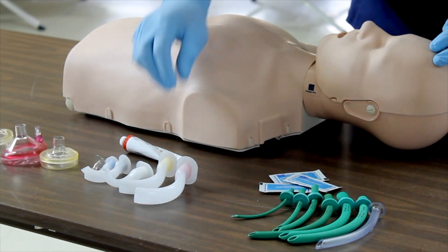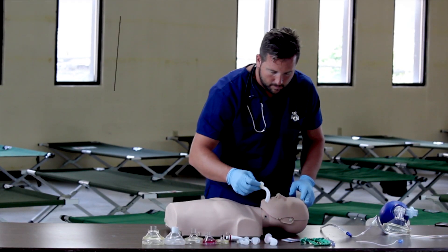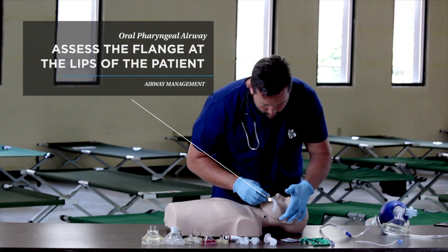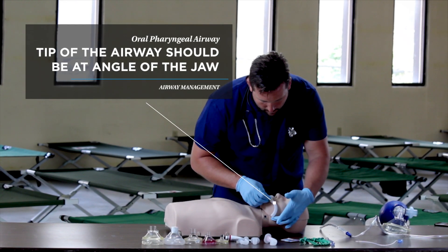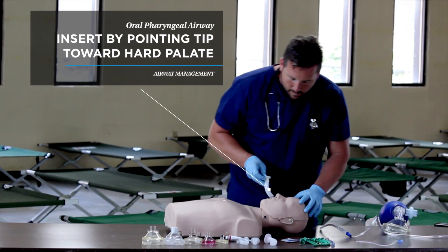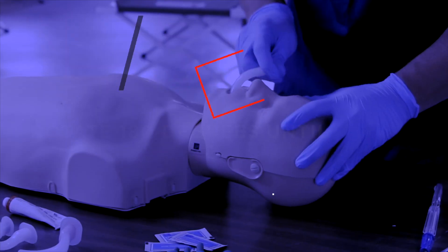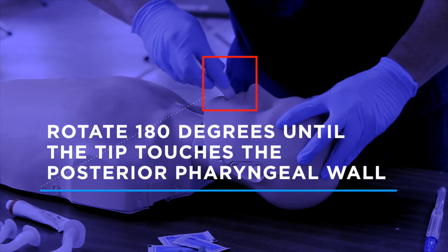Selection of the proper size oral pharyngeal airway is done by assessing the flange at the lips of the patient; the tip of the airway should be at the angle of the jaw. Insertion is achieved by pointing the tip toward the hard palate and then rotating 180 degrees until the tip touches the posterior pharyngeal wall.